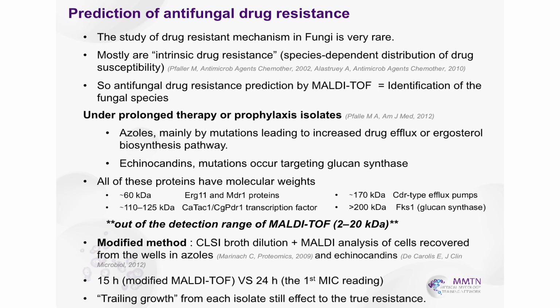Not most of the researchers, they still try to identify the fungal species and try to predict anti-drug resistance by MALDI-TOF. How about under prolonged therapy? They also try to do broth microdilution, then get the cultures from the broth microdilution and identify the protein. If they have the hotspots, enough protein, it will work. But we still have less information about drug resistance for yeast and mold. So it's another question, is that good or not?